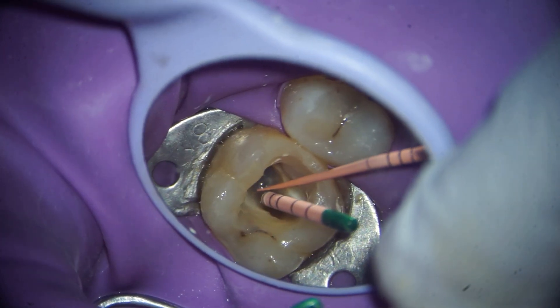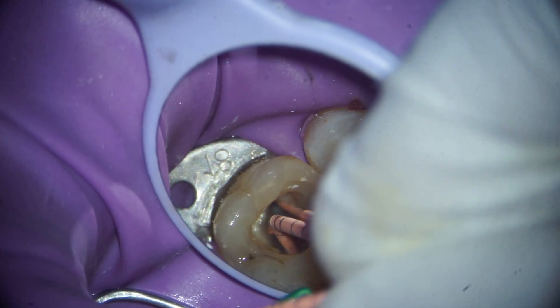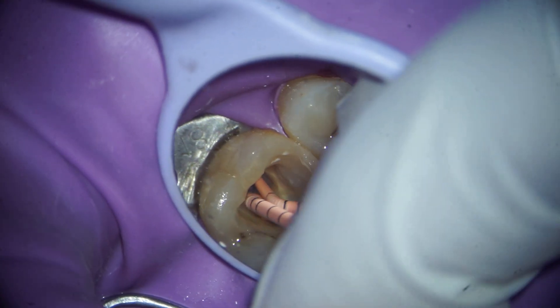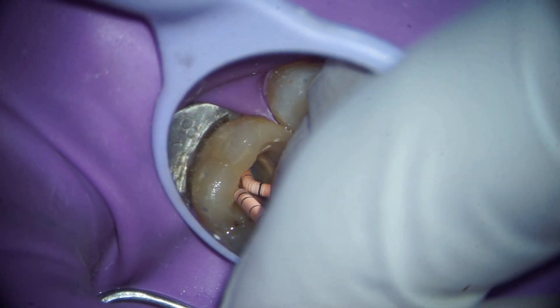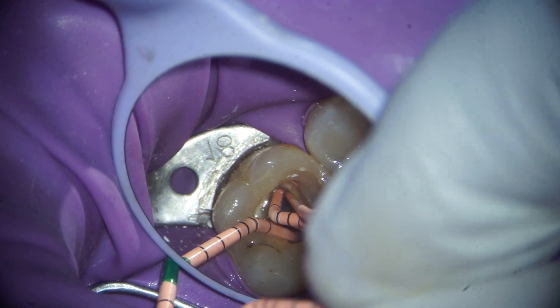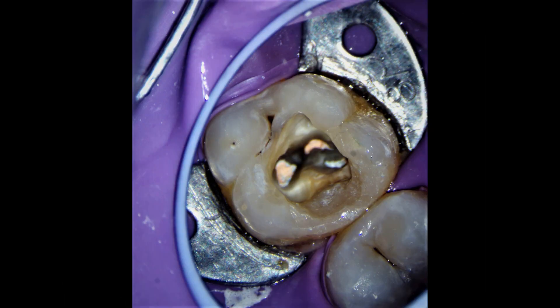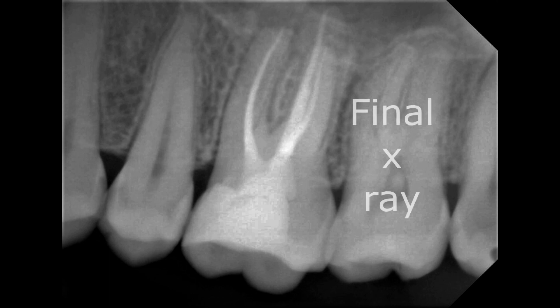Now placing the master cones — this was the palatal cone, this is the disto-buccal master cone, this is the mesial buccal master cone, and now I'll be placing the MB2 master cone, which doesn't reach the apex because both canals are confluent. This is the master cone X-ray. I adjusted the mesial buccal cone, cutting 0.5 millimeters, and this is the final X-ray after obturation.